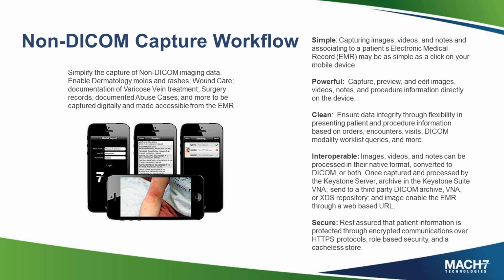and visit. But for those specialties like dermatology and wound care, how can we capture videos and photos and take notes and things like that efficiently? Does your VNA vendor that you're looking at have tools that enable you to present a pick list of patient visits, just like a tech would do in radiology? And from that pick list, then take pictures of the mole or the rash and associate it to that patient and visit, and then have it sent to the VNA. Let's learn from those other departments and figure out how we can optimize those workflows.